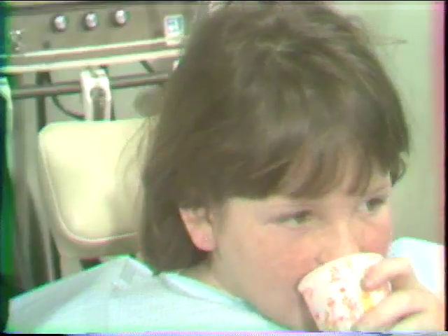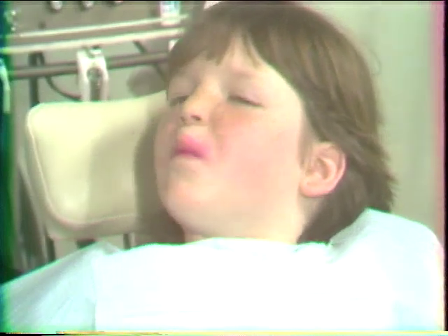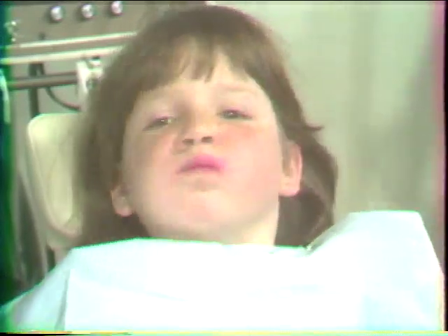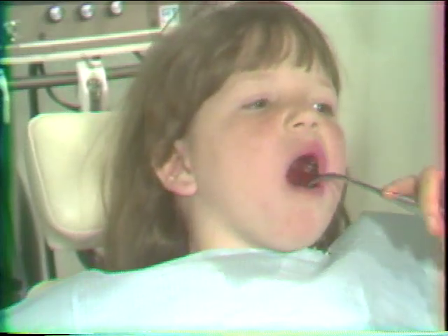The technique for the clinical fluoride therapy. There are two suitable techniques we use for clinical fluoride therapy. One, the double rinse technique, which is best. First, dispense 1 ounce of APF, the red solution, into a plastic cup, 1 squirt of the plunger. Second, dispense 1/2 ounce of the stannous fluoride, the tan solution, into the second plastic cup, 1 squirt of the plunger. Dilute with 1 ounce of water just prior to use.